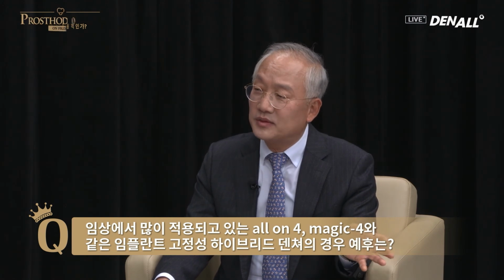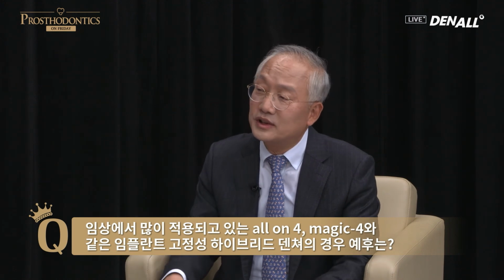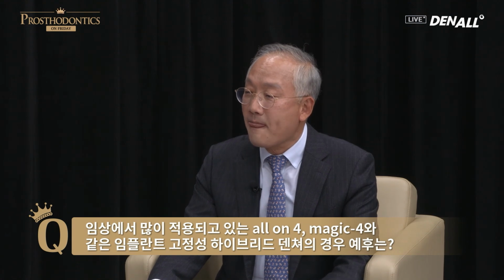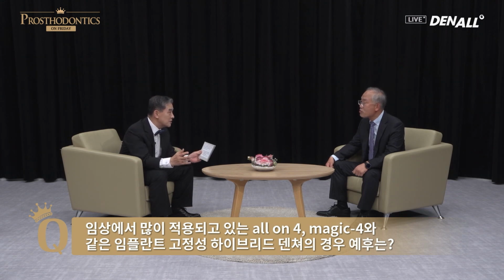As mentioned, I prefer placing 6 implants, separating them and dispersing them so that even if one side breaks down, the patient will still be able to function using the rest. With All-on-4, if one goes wrong, sometimes you need to remove the entire thing. That is my opinion. In OSSTEM, Magic 4 is available now.